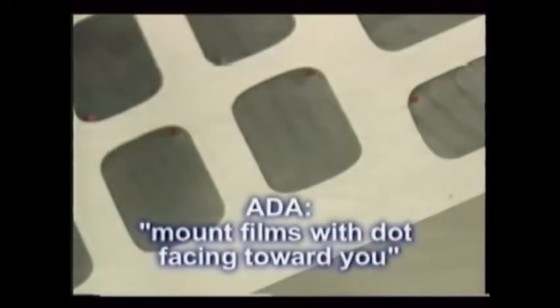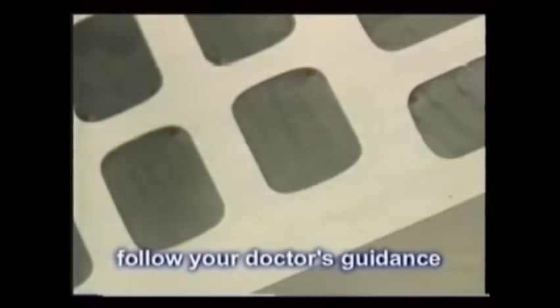The American Dental Association standard says to mount and to view the intraoral films with the dot facing you. This mimics looking at the patient face-on when viewing the mounted films. However, follow your doctor's guide and base the film mountings on his training and habits, since he has to read the films.